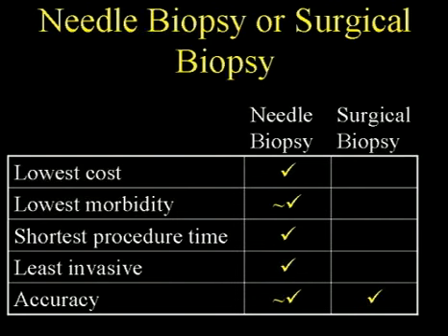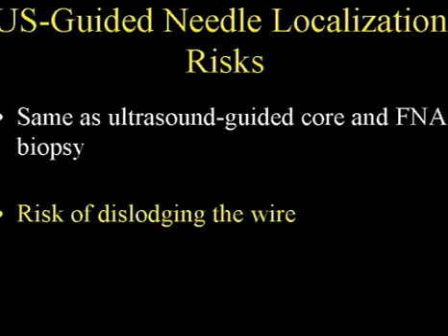This is from the ACR. Needle biopsies have been shown to have a lower cost, lower morbidity, shorter procedure time. They're least invasive and have similar to equal accuracy as surgical biopsy. So really, like I said, needle biopsy has largely replaced surgical biopsy, although certainly if the patient or surgeon wants a surgical biopsy, that is an option also.